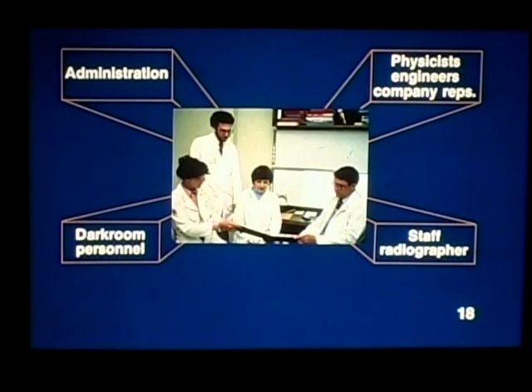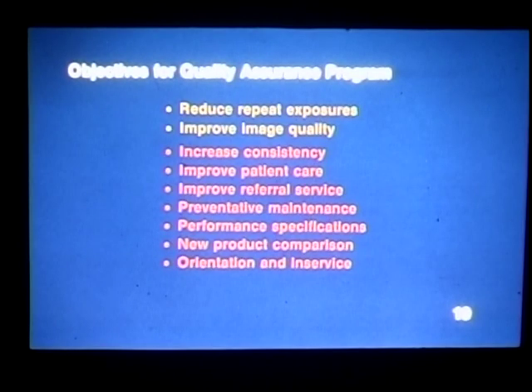Number 18. In large radiology departments, quality assurance programs operate more effectively under the direction of a quality assurance committee. The committee's primary function is to maintain lines of communication among those individuals involved with the program. In addition, the committee should establish policies and individual responsibilities. Representatives from each part of the quality assurance program serve as members of the committee. In smaller departments, the person or persons performing quality assurance measures, along with professional service engineers and outside consultants, serve as the Quality Assurance Committee.